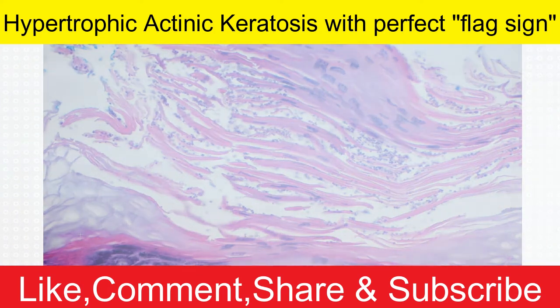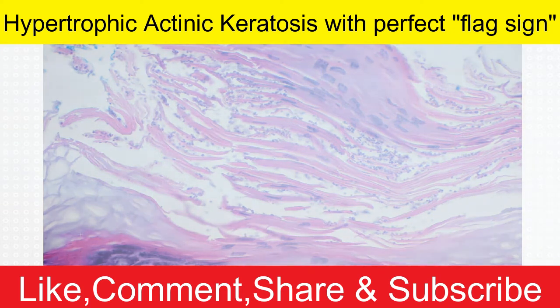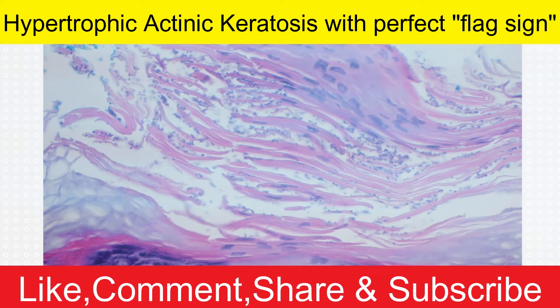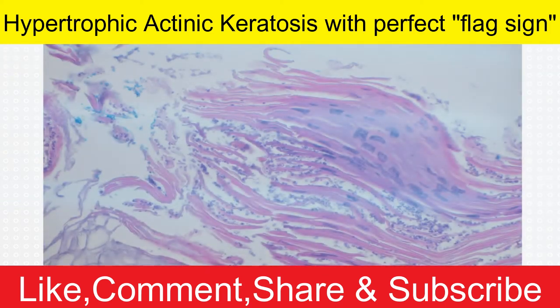The other thing is that unlike a lot of fungus that look clear on hematoxylin and eosin stain, the Malassezia / Pityrosporum yeast are purplish in color. They're usually easy to see on a regular H&E stain, even without a fungus stain. You don't have to do a special GMS or PAS stain to see these fungi most of the time. Candida yeast look almost identical to these. And so these are not causing a problem. They're just growing here, hanging out there. I don't even mention these in my report because it's a normal finding, basically.